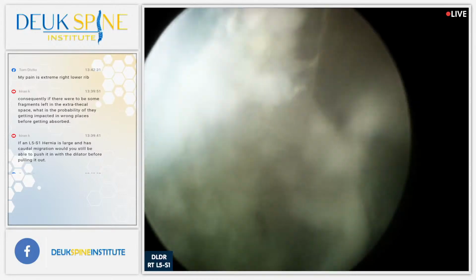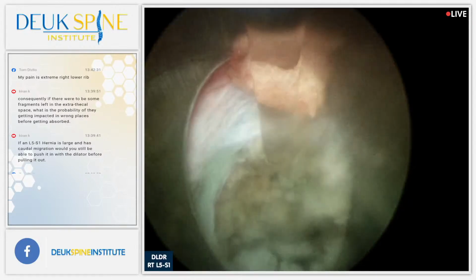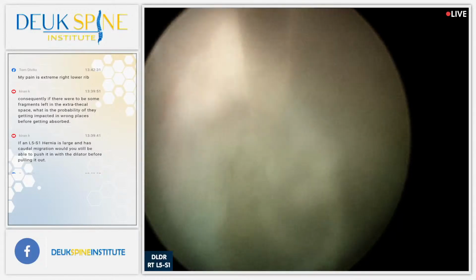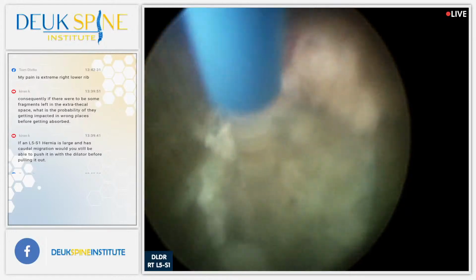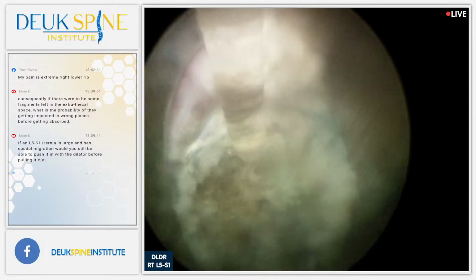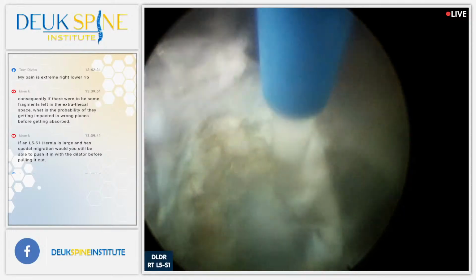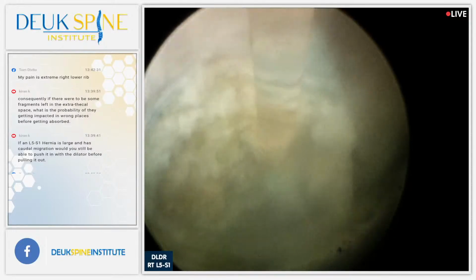Any more questions? Yes, these next 2 questions come from Kieran on YouTube. Nice to meet you, Kieran. Welcome. First question they ask: if an L5 to S1 hernia is large and has a caudal migration, would you still be able to push it in with the dilator before pulling it out?